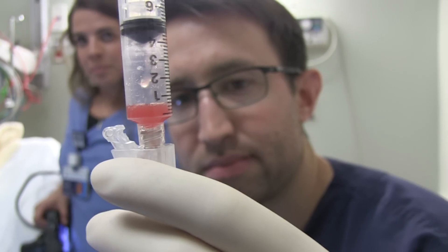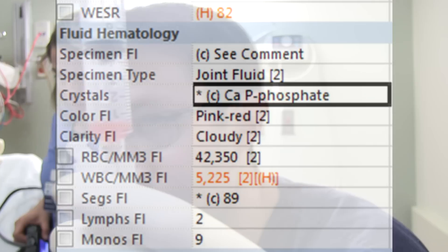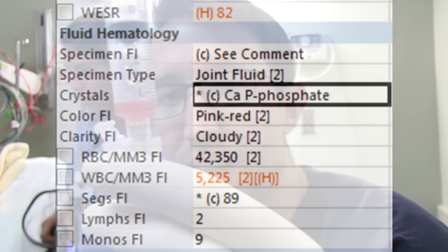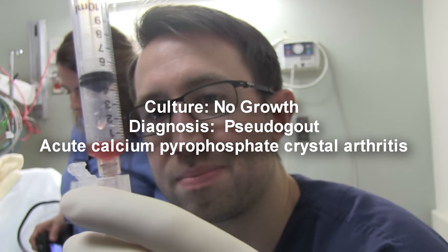So what are you going to order on this, Frank? The differentials are all kind of going in my... Crystals too? Get a culture on that? If we have enough — yeah, I would want crystals and a culture as well. The question is how much do I need for that? Not a whole lot. I think we should be able to get all of that on this.